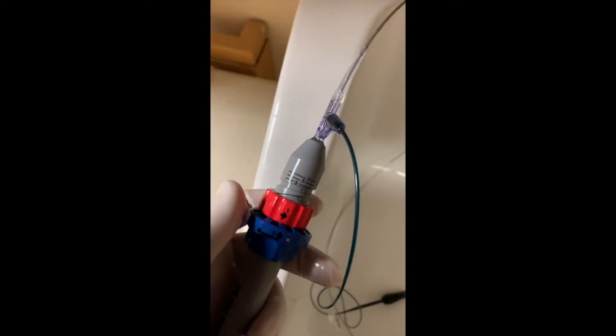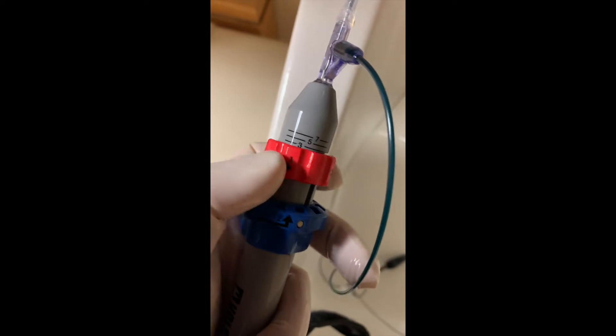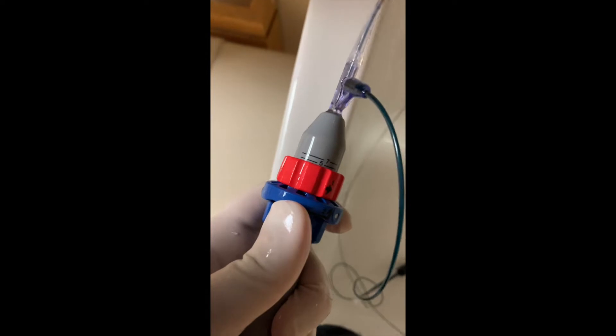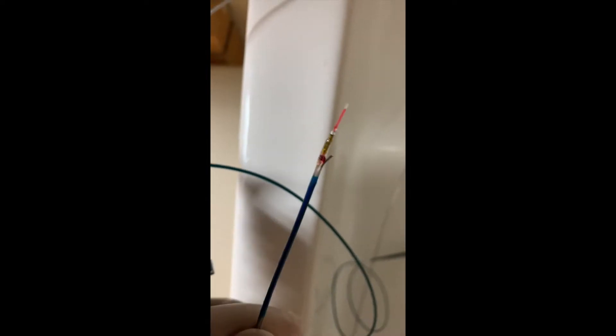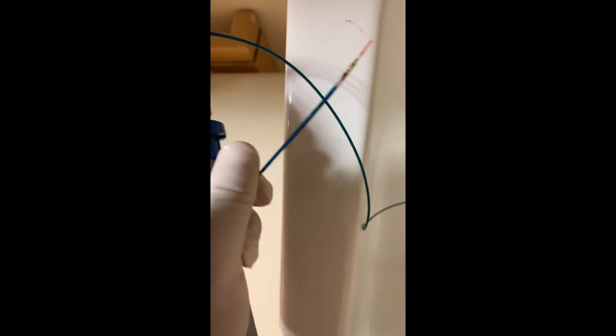You can twist the red portion to various positions to determine how far your needle will come out, and the blue portion when pressed firmly up will deploy the needle — but don't forget to retract it before removal. If you're not certain how far to extend the needle out, I recommend you start at setting three, then five, then seven until you're successful.